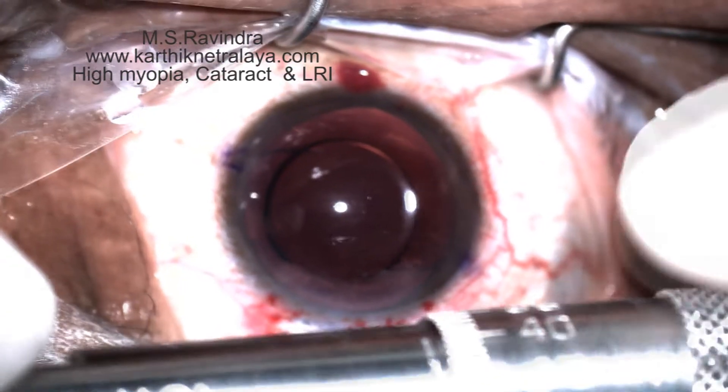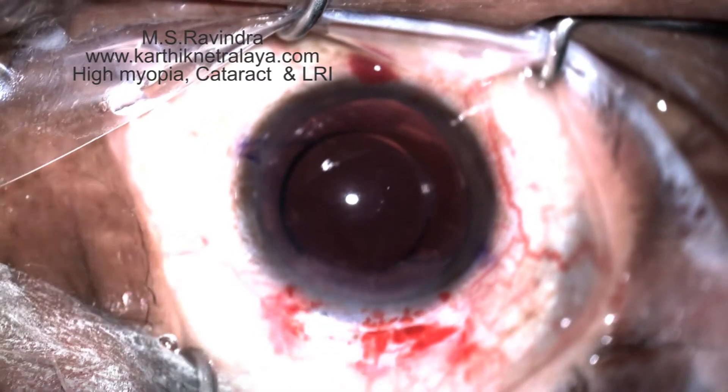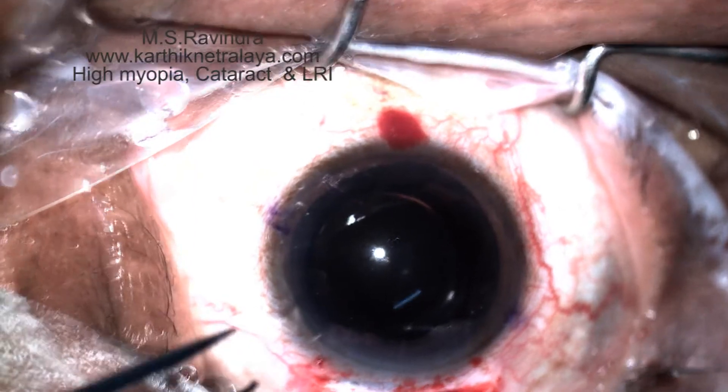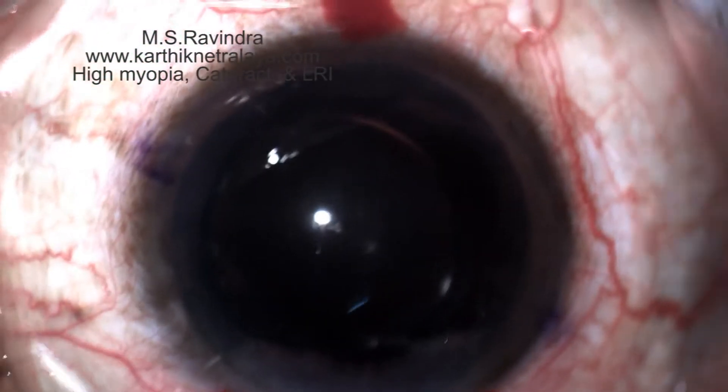650 microns depth of the diamond blade is adjusted. A toric marker is used. Two clock hours of arc of LRI is created.